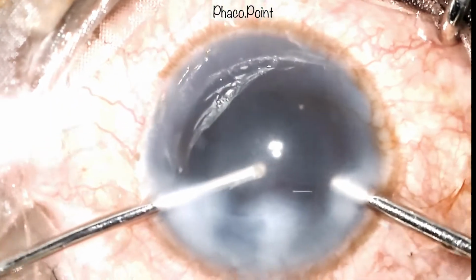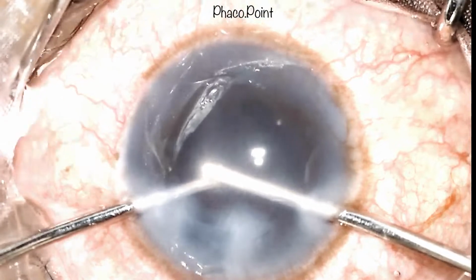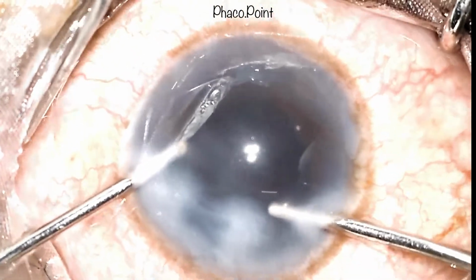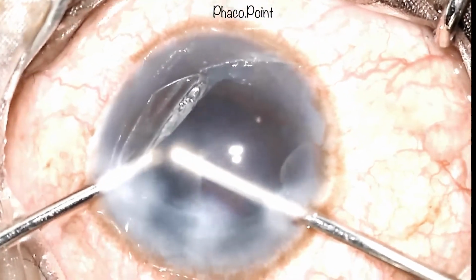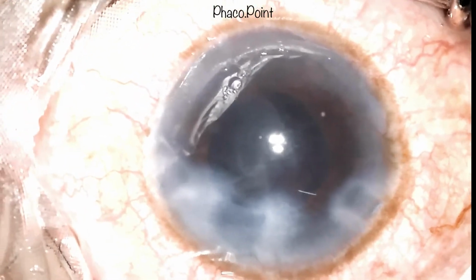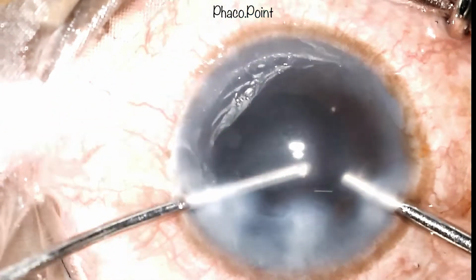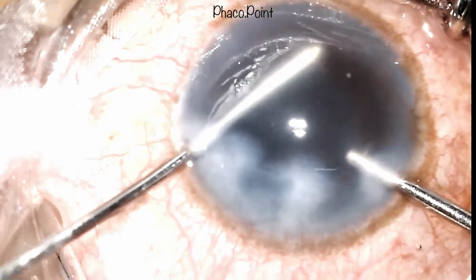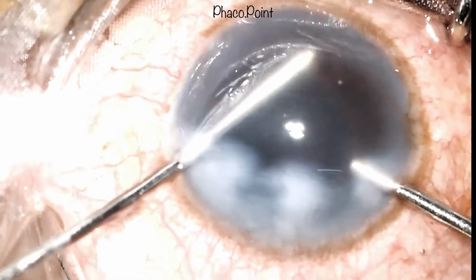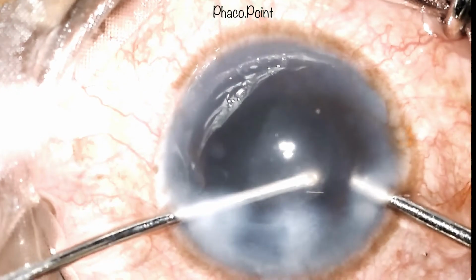The surgeon accidentally holds on to the Descemet's and rips it across its entirety. Upon realizing this, the aspiration is stopped, the Descemet's left in its place, and both the instruments removed. Let's watch this in slow motion again. Watch how the aspiration cannula grasps hold of the temporal half of the Descemet's and strips it almost entirely all the way to the nasal end.